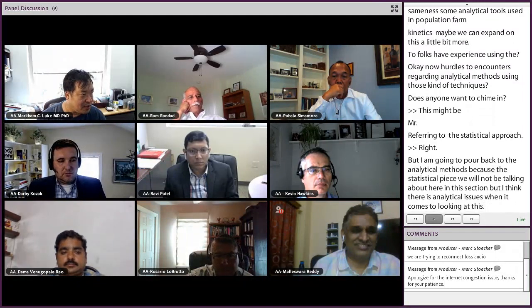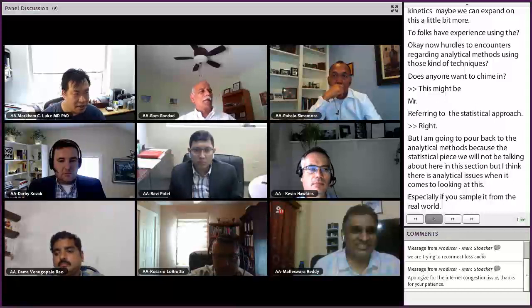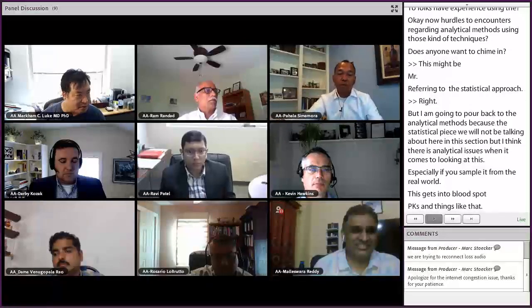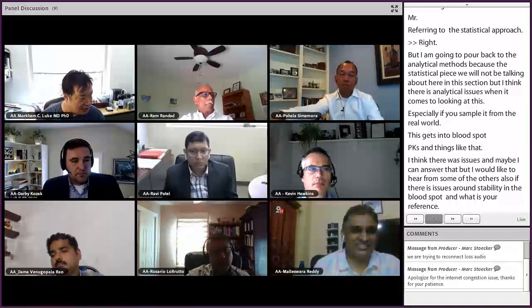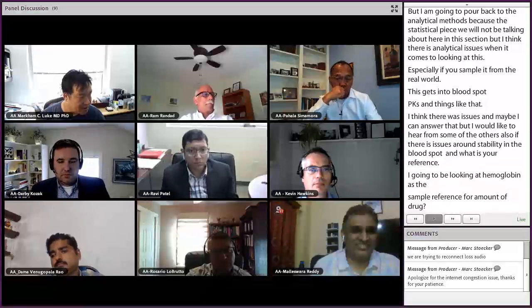Maybe I can start answering that, but I want to hear from some of the others as well. There are some issues around stability of the analytes, for example, in the blood spot. What is your reference? Are you going to be looking at hemoglobin in the blood spot as your sample reference for amount of drug? There are some challenges to doing that. Of course, some of that has been worked out. Does anyone here have experience doing this, or with analytical chemistry techniques using those kinds of techniques?